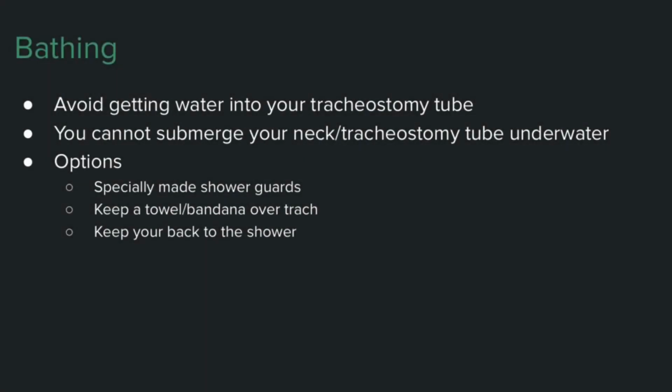Avoid getting water into your tracheostomy tube. It is okay to shower or bathe, but you may need to adjust your routine. Options include specially made shower guards, keeping a towel or bandana loosely over the tracheostomy to keep water from getting in, or keeping your back to the shower.